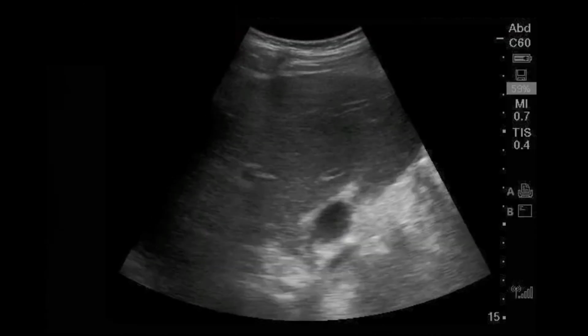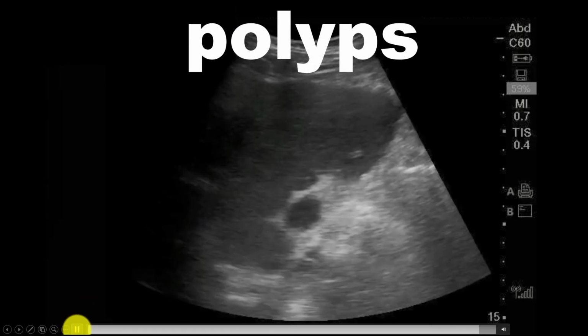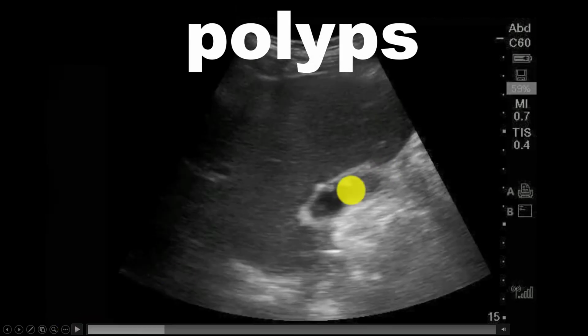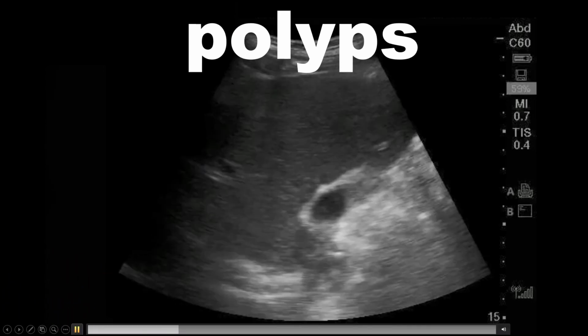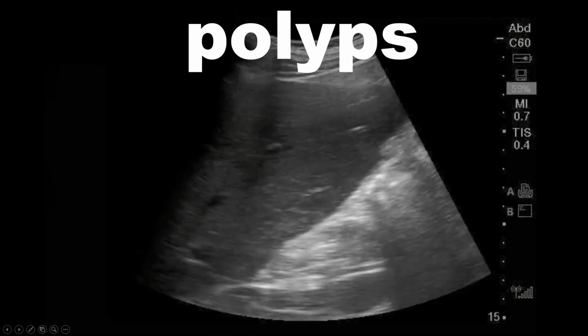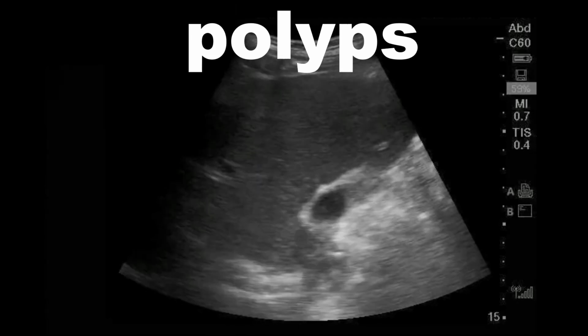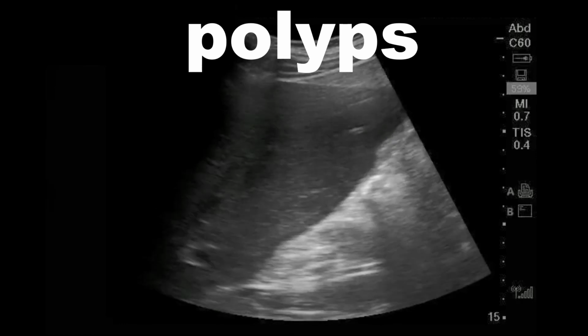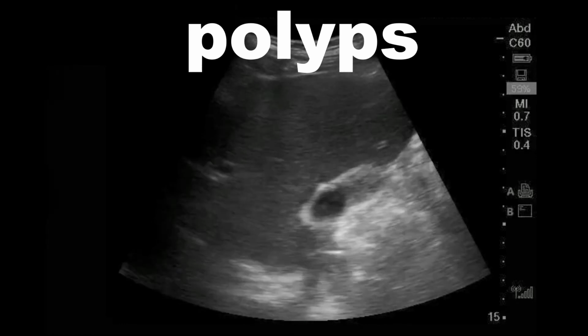And then here is another example. This is actually gallbladder polyps, and this patient has several polyps, which we see pretty nicely right here. Polyps typically don't shadow, and they don't move when you're rolling the patient from side to side. They're also typically less than 1 centimeter in length. If you do see a gallbladder polyp, it's important to note because those patients typically need follow-up to ensure that they don't develop into a carcinoma.